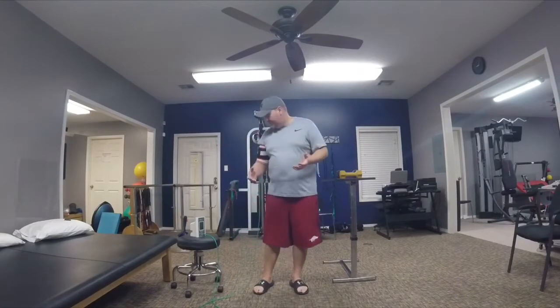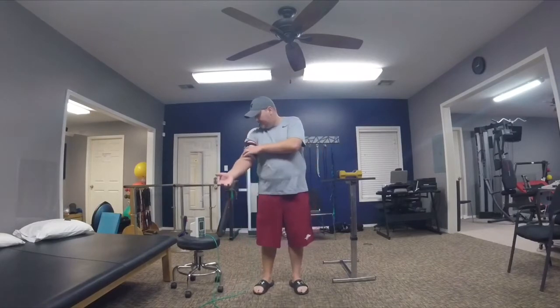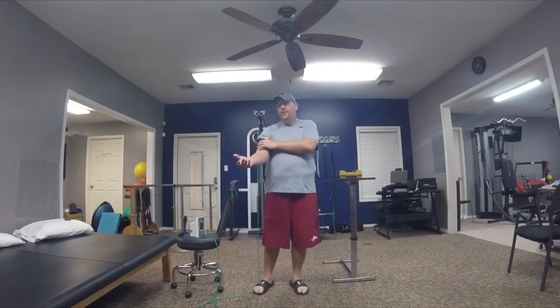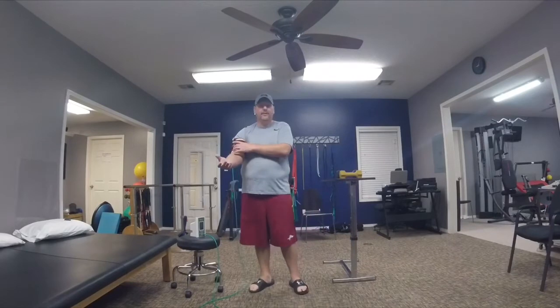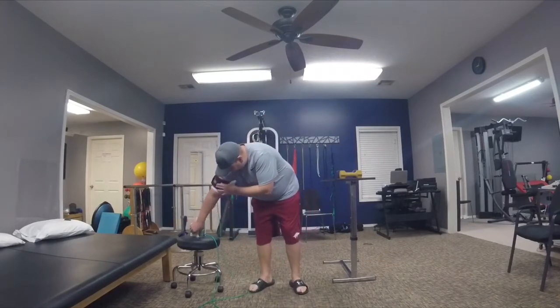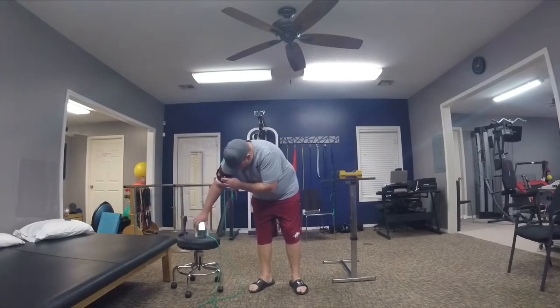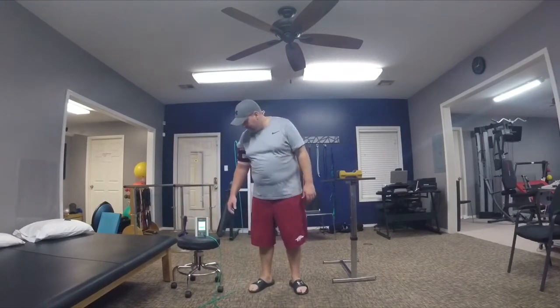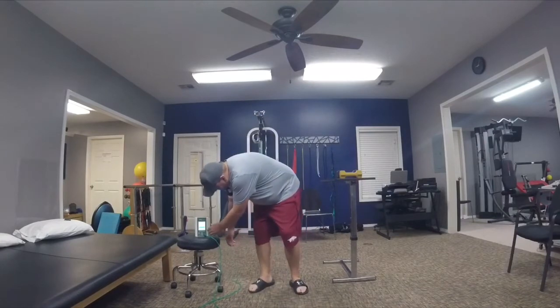So what I'm going to do first is turn on the machine, and we're going to figure out exactly what the total occlusion is for my arm, and then for the upper extremity we're going to exercise at 50% of that total occlusion. So I'm going to turn this machine on, and we're going to see if I can be still enough to get that reading. So I'm going to try it first without having to lay down.